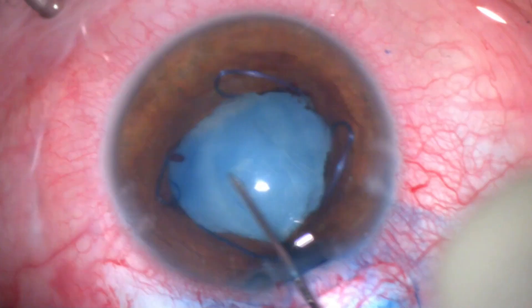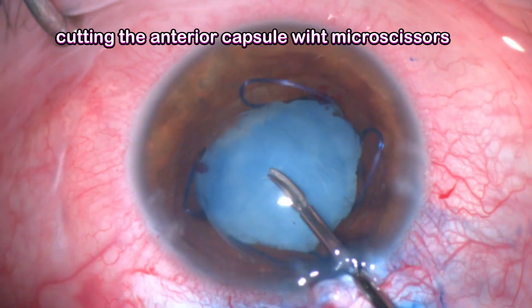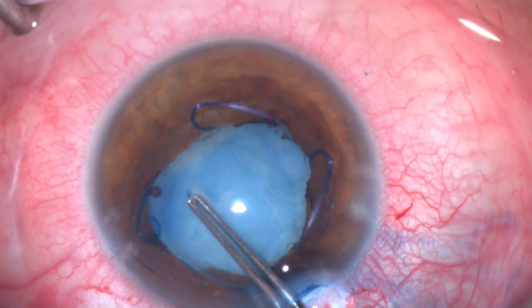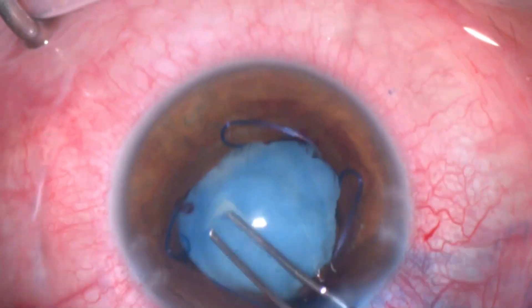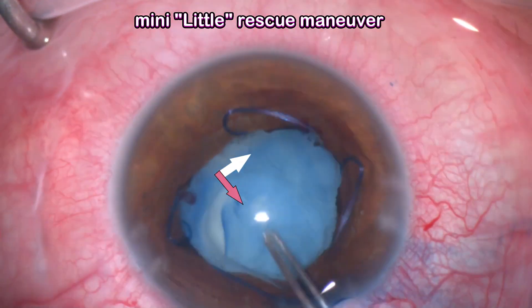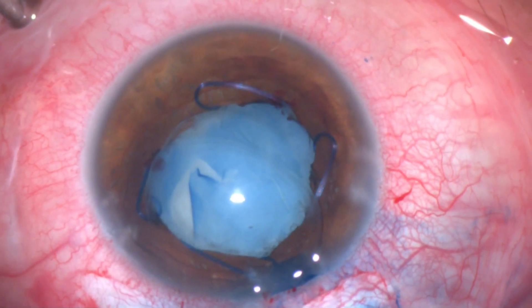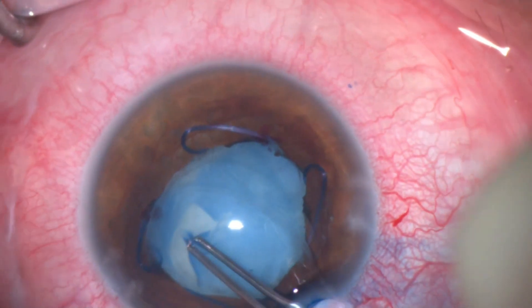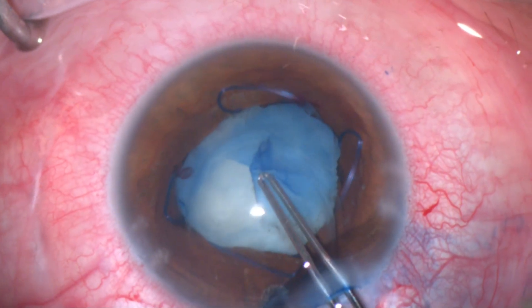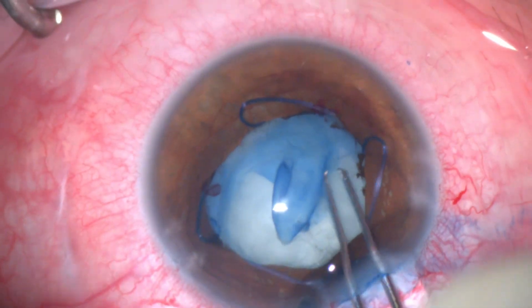I tried again with a sharper tip capsulorrhexis instrument. It didn't open easily, so I used a needle tip again with the forceps. Then I decided to use micro scissors to make a cut through the anterior capsule — it opened. Then slowly extending the capsulorrhexis; the technique here is a bit different, using a mini maneuver where you pull the edge of the CCC towards the center.